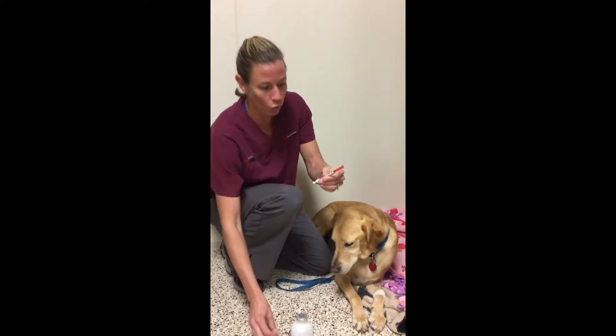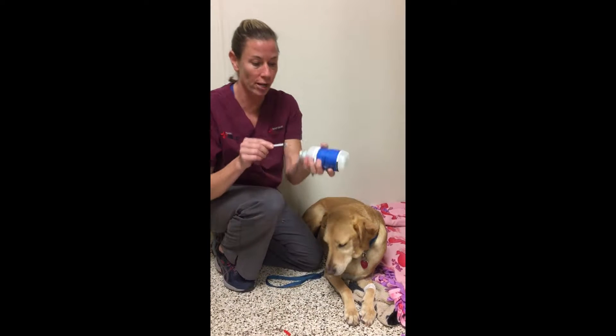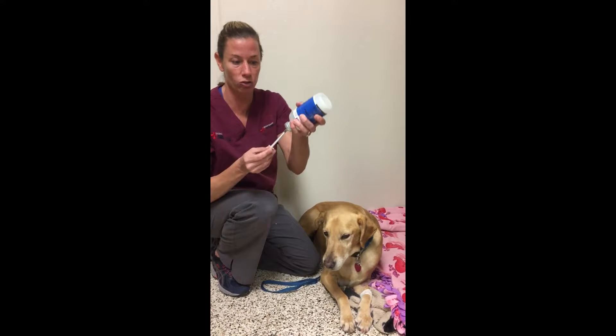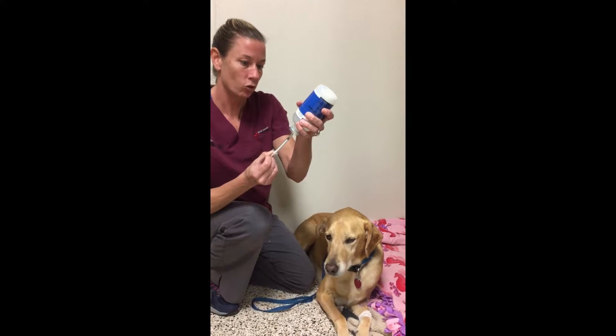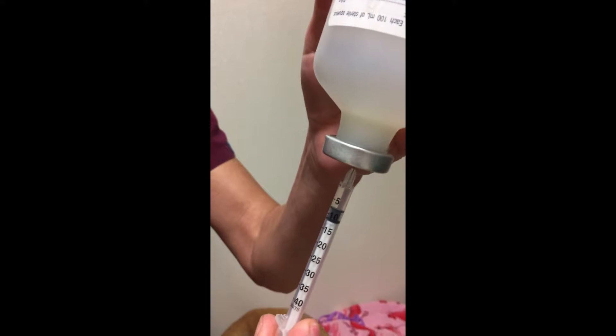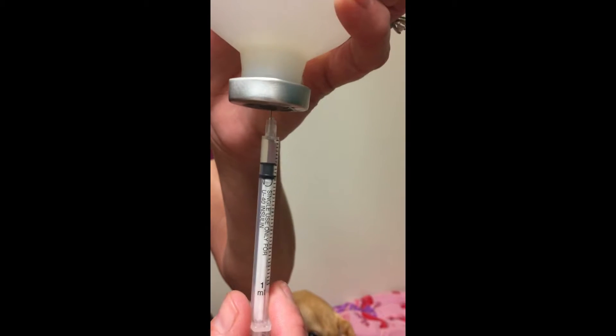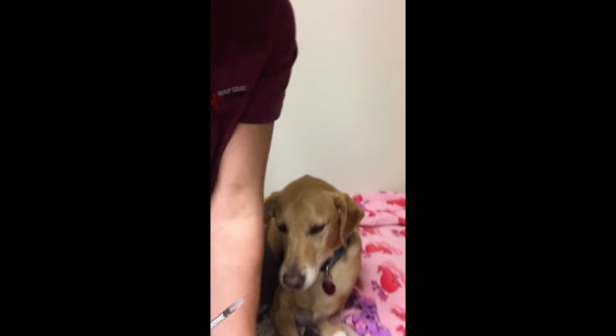Toby's dose is 6 units every 12 hours, and we're going to simulate the injection with some saline because he's already had his morning injection. So instead of using insulin we use saline, and you're just going to draw up to the little six — the little hash mark for six.